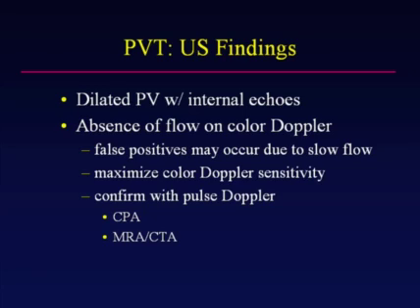In addition, because pulse Doppler and power Doppler are more sensitive for detection of flow than color Doppler, you always want to confirm your impression on the color Doppler with a spectral tracing or color power angiography. And if further questions remain, you should get a confirmatory study using MR or CT.